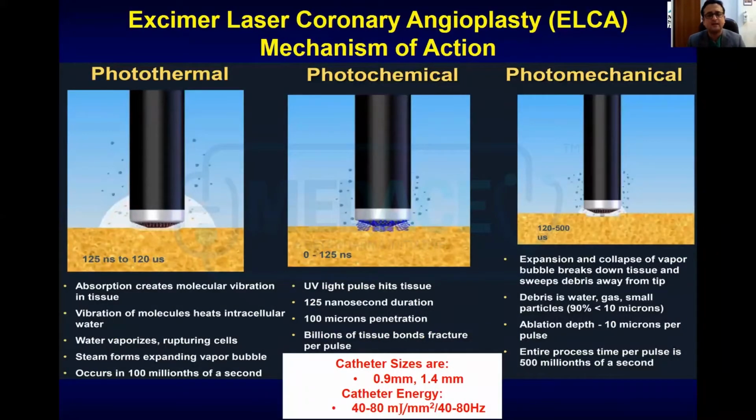Then we have laser. I know a couple of places in Pakistan have it as well. It works in multiple ways, photothermal, photochemical, photomechanical, and that's a different talk. So I'll leave it to that particular talk.